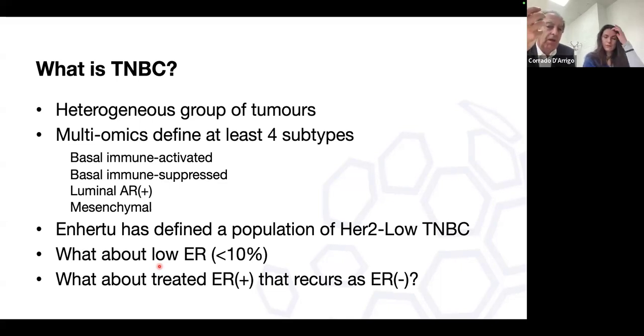So eventually, we could report ER negative or ER positive rather than giving this value, if you want to assist the oncologist in assessing the drug. What I didn't know was that the oncologist cannot prescribe if we write in our report ER weak positive or positive, even if we put a percentage there that is not less than 1%. So this is interesting.